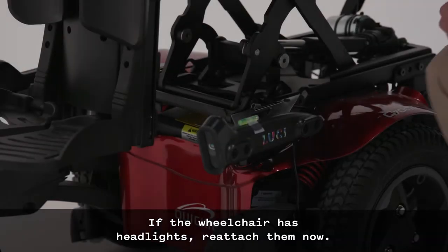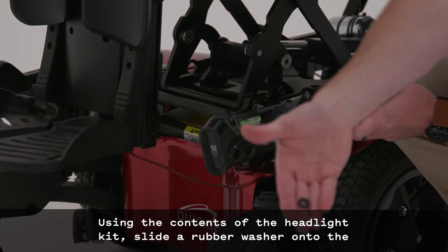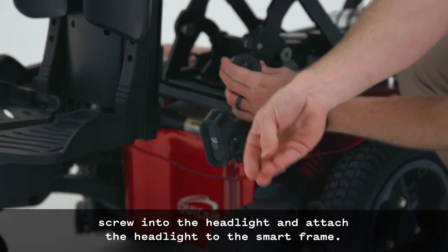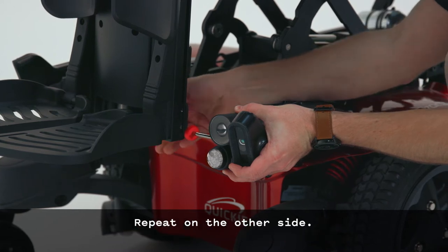If the wheelchair has headlights, reattach them now. Using the contents of the headlight kit, slide a rubber washer onto the threaded stud. Insert the M4 x 25mm screw into the headlight and attach the headlight to the smart frame. Repeat on the other side.